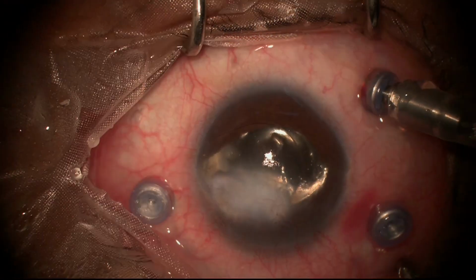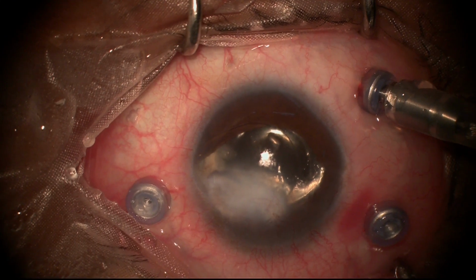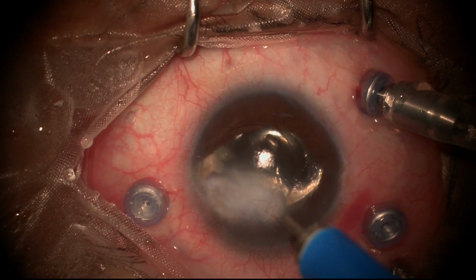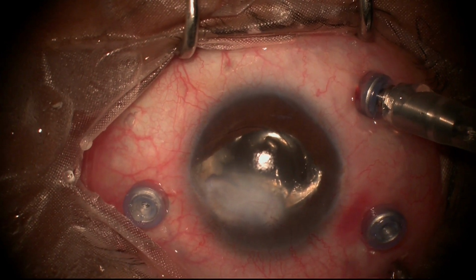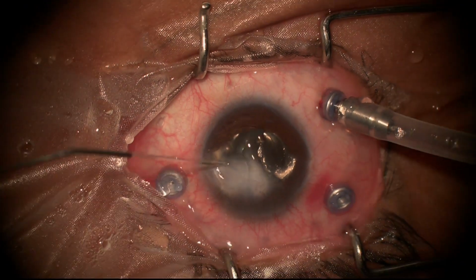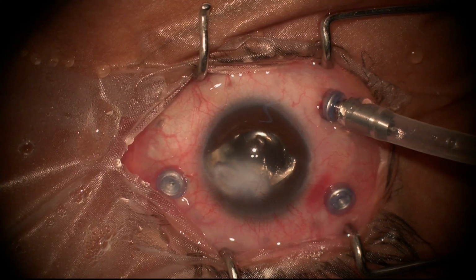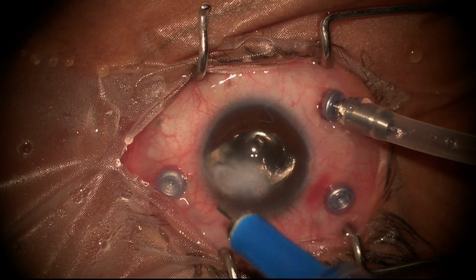You think she would be... we have the IOL subluxating into the anterior chamber. Keep the cornea wet, it is getting dry. Now this is the added problem. This will touch the endothelium. It will make this cornea also unviable.